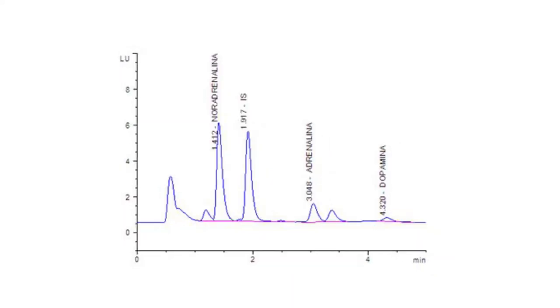This is the typical chromatogram of the level 2 control where you can see that the peak of the noradrenaline comes out at 1.41 minutes, the peak of the adrenaline at 3.05 minutes, finally the dopamine comes out at 4.32 minutes.